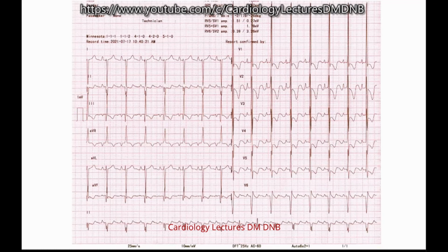You think it is left axis then? Is it left or right axis? Maybe we can say about clockwise and transverse loop. No, I think don't make it more complicated. Very simple question. Is it left axis deviation, right axis deviation, or you don't know? Just three answers, one of the three. We are not asking you about the loop first.